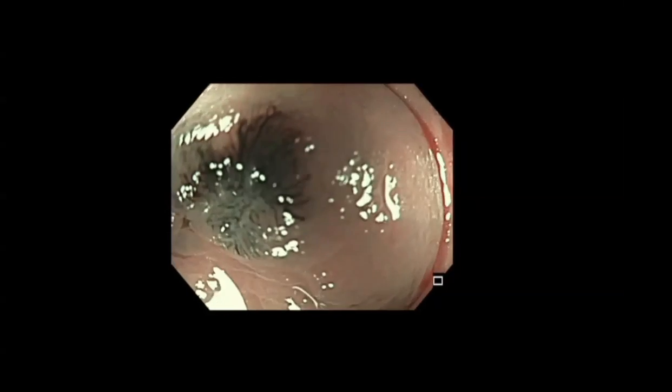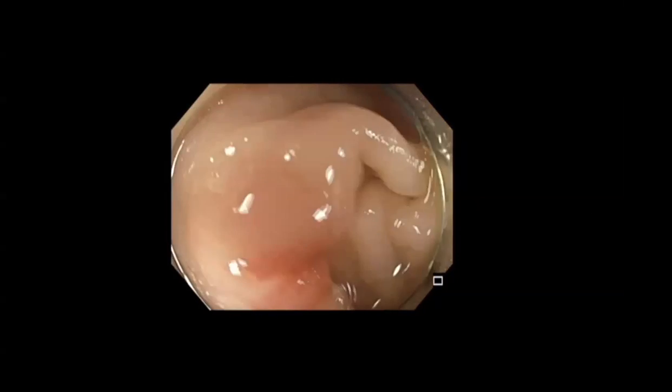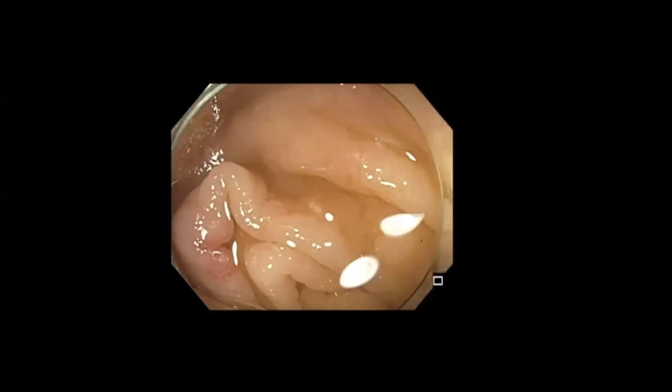And when you do narrowband imaging, can you see any vessel draining from that area? So as you can see here, this is something important. I want to share this for the sake of first-year fellows. You can see the fold.